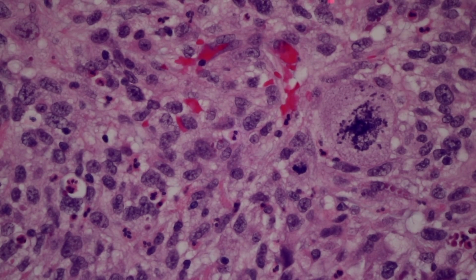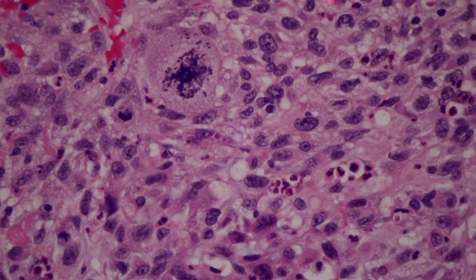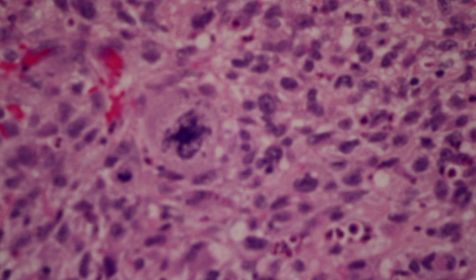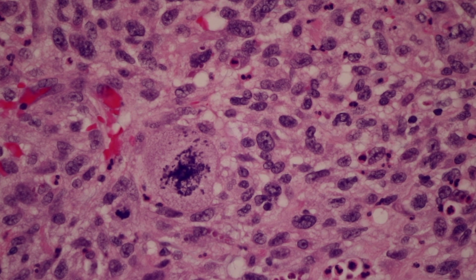And look there, huge atypical mitosis in this squame. I mean, you could almost karyotype it and that thing has like 500 chromosomes. Really crazy wild atypia and mitoses that we can see in squame. And this is a great example of poorly differentiated. Looking at this field, you'd have no way to be sure that this is squamous cell carcinoma on this field alone. You'd have to do immunostains to prove it. So I would say when you've got areas like this, you can confidently call it a poorly differentiated squame once you've proven that it is actually squame and not something else.